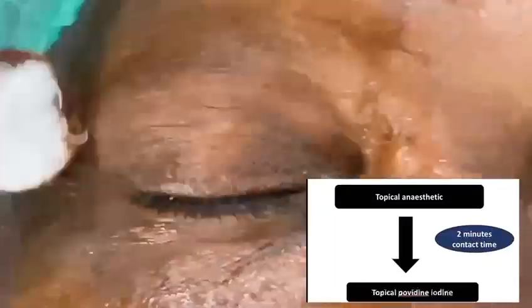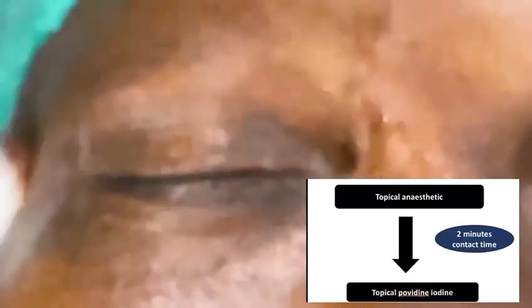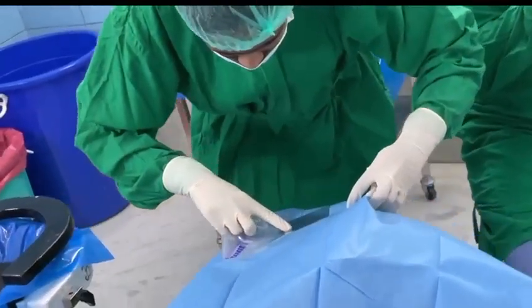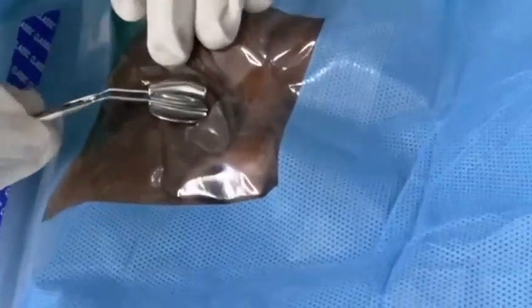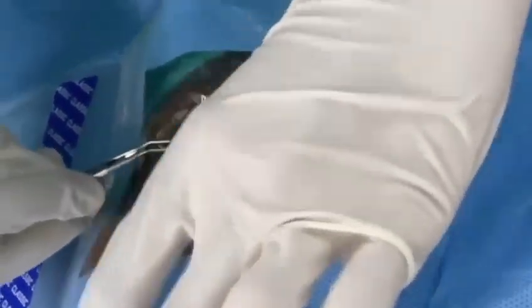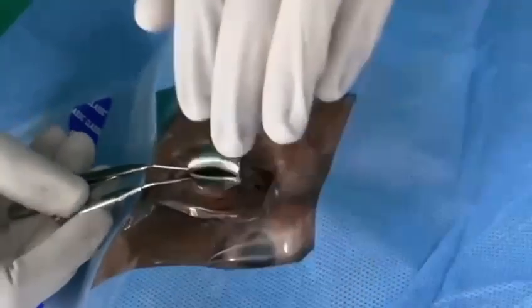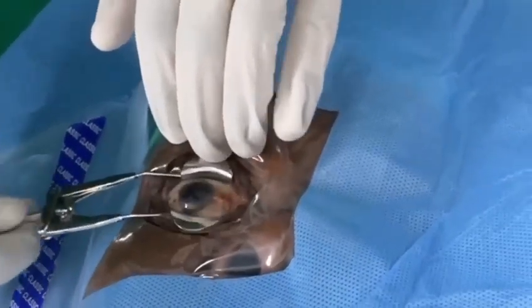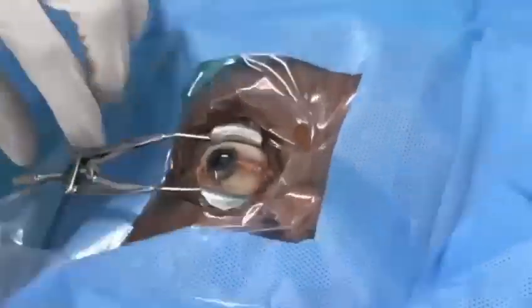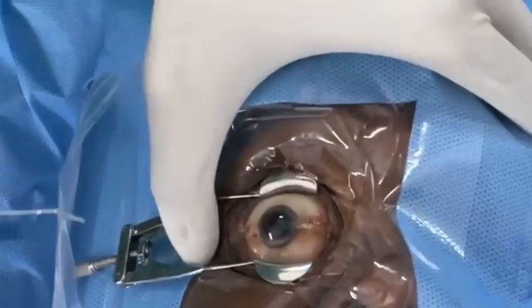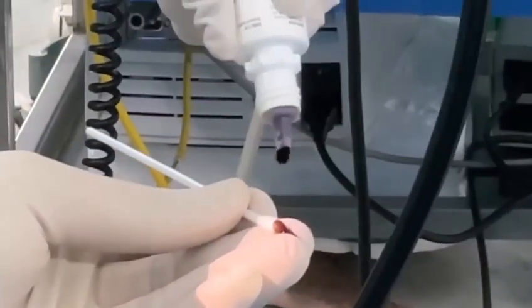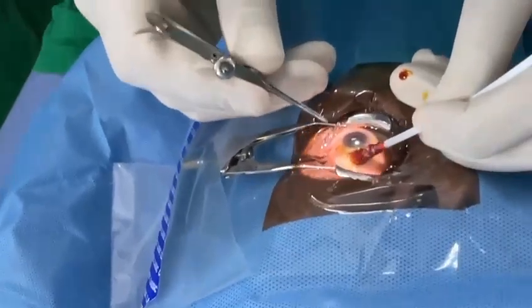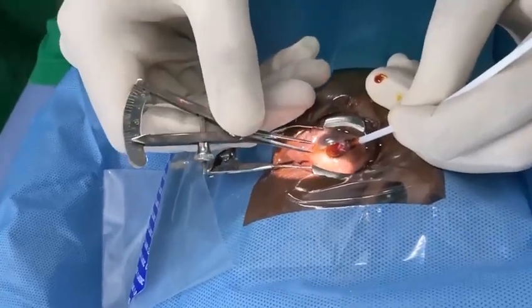Topical anesthetic and topical povidone iodine is instilled in the eye and the eye is cleaned externally as well. The eye is draped. A plated speculum is applied to cover the lid margin and prevent the eyelashes from entering the injection field. The eye is thoroughly washed with balanced salt solution. Povidone iodine is instilled on a cotton swab and the conjunctiva is retracted with a cotton swab.